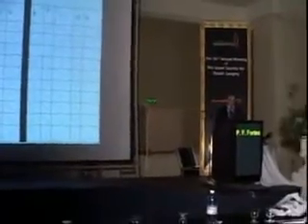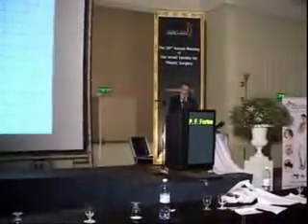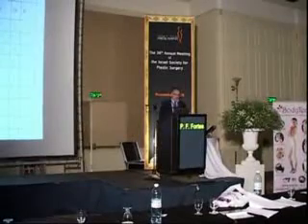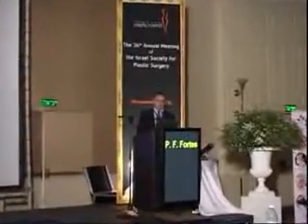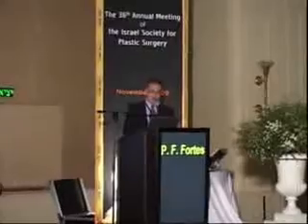In a separate category, which we refer to as comfort and healing categories, we also asked patients questions such as, the garment cooled my skin, the garment was easy to put on or take off, the garment reduced my swelling when I wore it, the garment reduced pain and swelling when I wore it, and so on. And additional questions related to garment care and aesthetics, such as, the garment resisted staining or was easy to clean, smelled fresh, or developed an unpleasant odor. And then we asked them to rate the garments overall so that they had a choice to pick the beige garment, the black garment, neither one. And then the last question related to if they could choose one garment to wear only, which one would it be, the black or the beige?